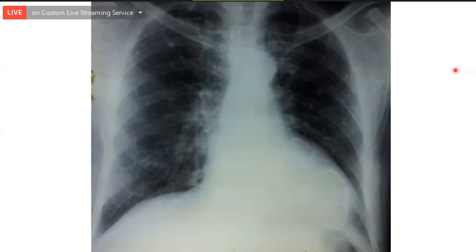So what are the structures which can get calcified of this nature? One is aneurysmal dilatation of the LV apex. Very good. A post-operative patient or post-infarction patient who has an aneurysm, fibrosis, can get calcified. And that can be one of the differential diagnoses.